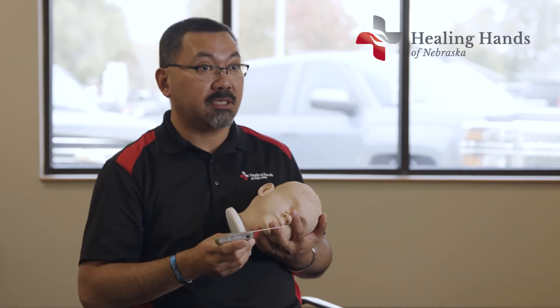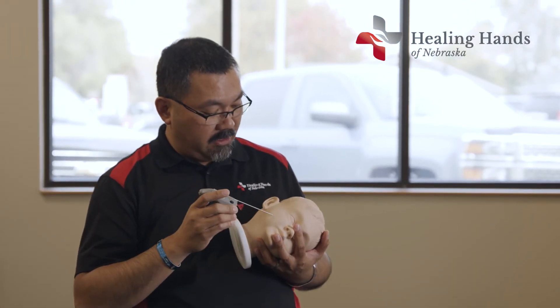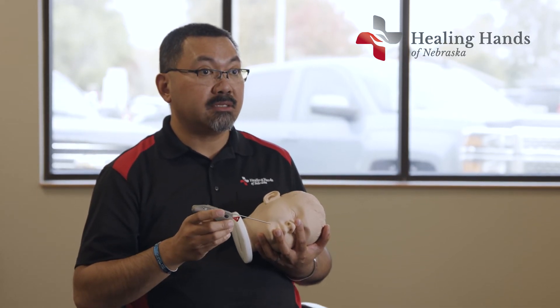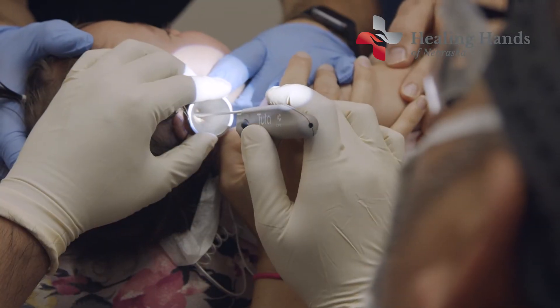I'm going to show you how that works. Normally I have magnification loops on, which allow me to see at a higher magnification. I look in there after the child has had his or her ears appropriately anesthetized and made nice and numb. I put the device in here like this, I press the button — boom — tube's in.